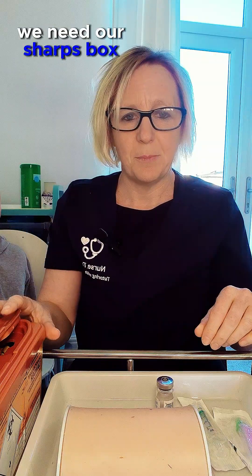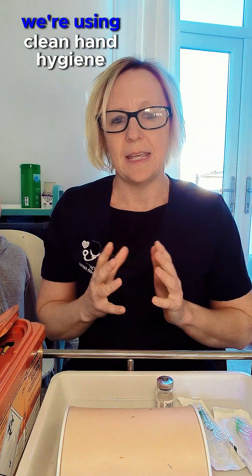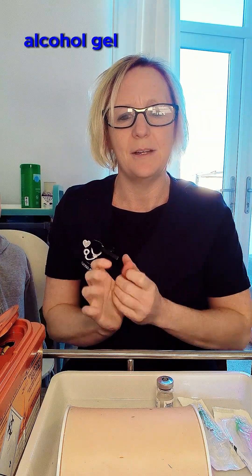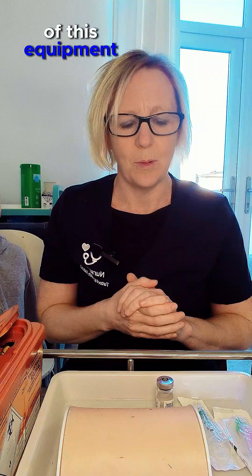We need our sharps box and we'll obviously need our medication. We don't need to use PPE but we do need to make sure we're using clean hand hygiene techniques. Before we set up and prepare, we're going to decontaminate our hands using the seven steps with alcohol gel, making sure we're using a non-touch technique and not contaminating the key parts of this equipment.